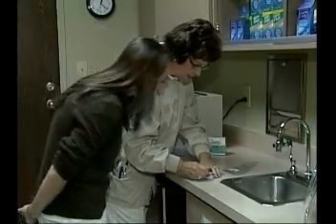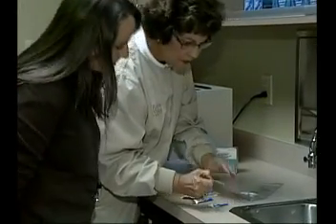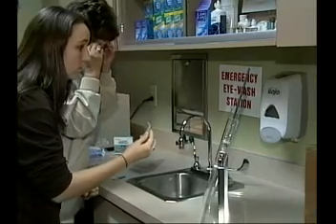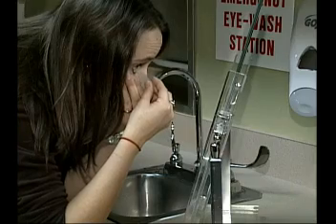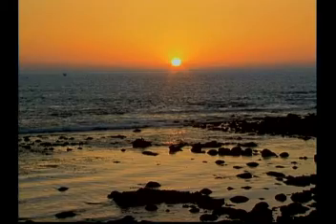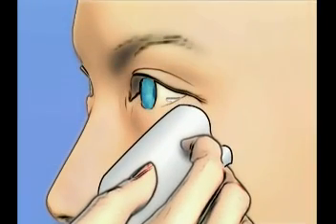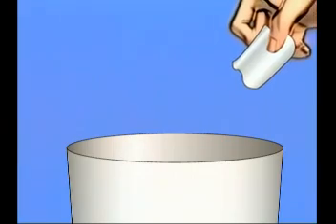Take the tip and pick up the Lacrisert, and then we're going to move to the mirror right here, and I'm going to ask you to take the Lacrisert in your hand. If possible, you should use Lacrisert for the first time while you are still in your doctor's office so that they can help you learn how to insert it. At the end of the day, much as you would with contact lenses, many patients like to remove Lacrisert before they go to sleep. This can usually be done by taking a clean tissue and pressing gently on your lower eyelid to expel any unused Lacrisert. Then just throw the tissue away.